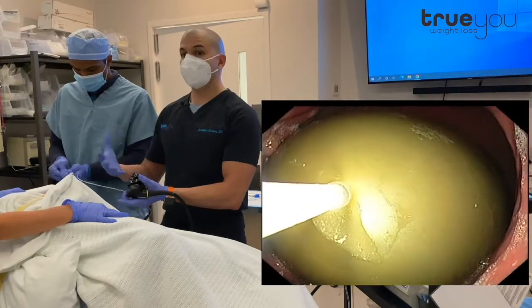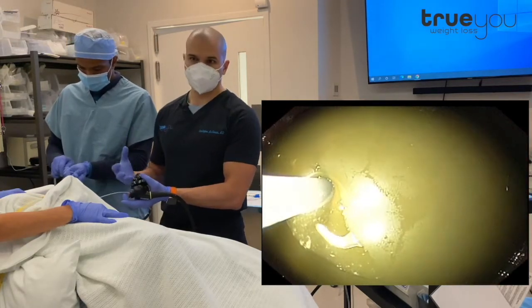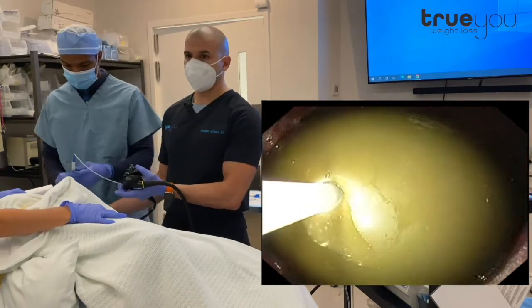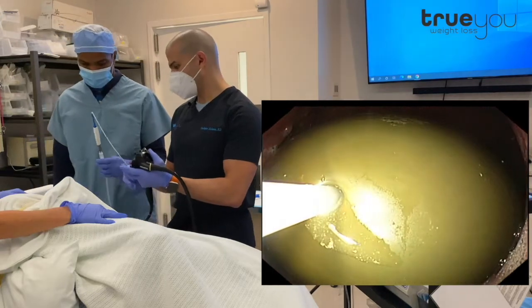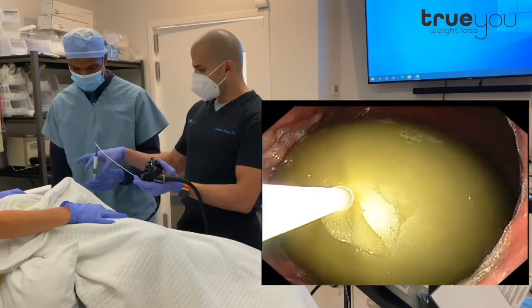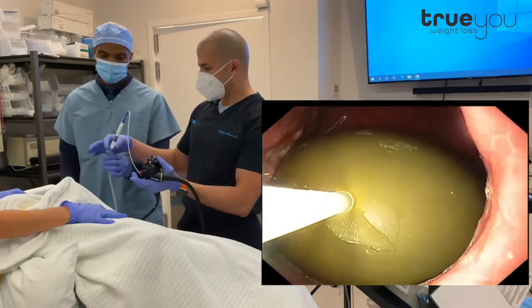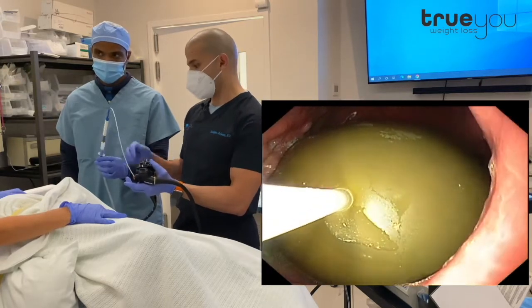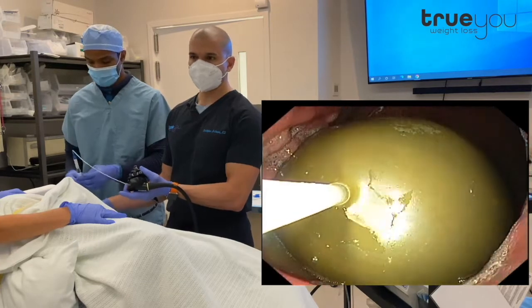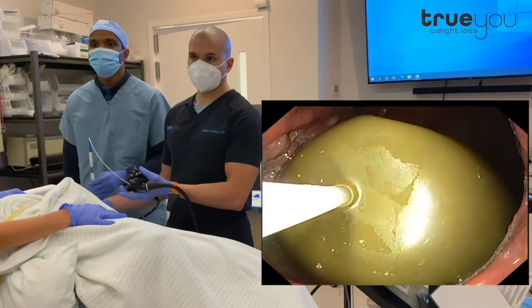Because she's had this balloon for six months and it's really a training tool, she's learned to eat smaller portions. She'll just continue doing exactly what she's been doing, and then she'll be able to keep the weight off. We're connected to suction and we are suctioning all the fluid out. A little trick is we like to use a small syringe attached to this device, which creates a suction lock and a vacuum seal, so we can suck the fluid out a lot quicker. It's just a couple of minutes to get this fluid out.